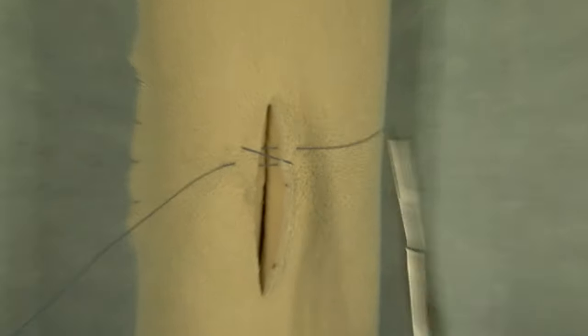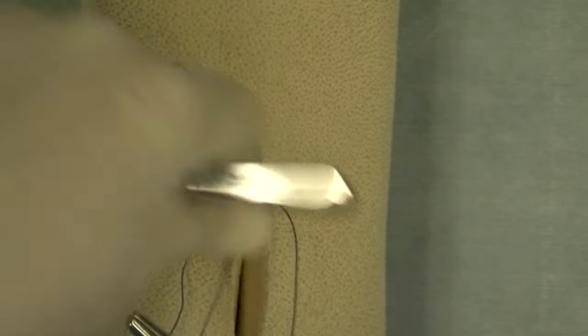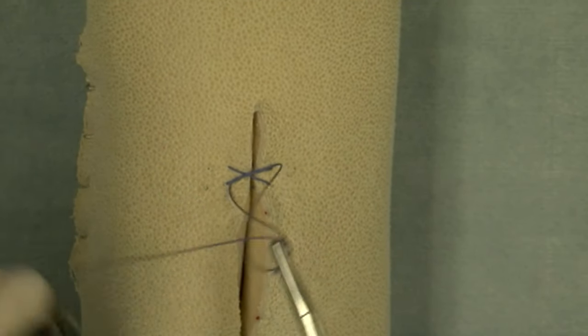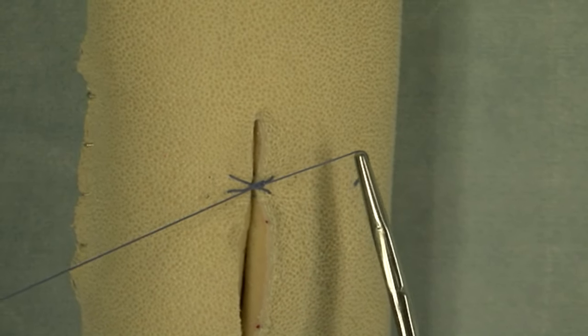hence the name cruciate. These are generally used under conditions of tension, so it's advantageous to use a surgeon's knot. Notice that I just created a surgeon's throw followed by a simple throw.